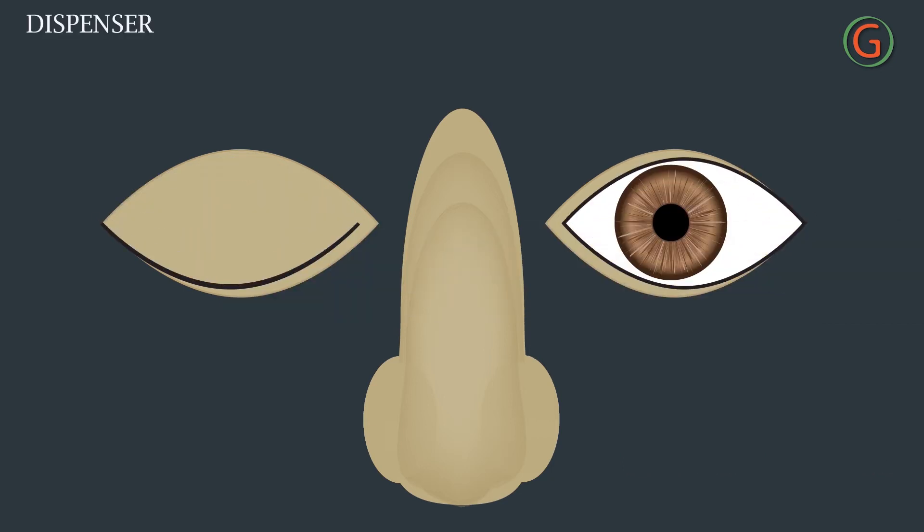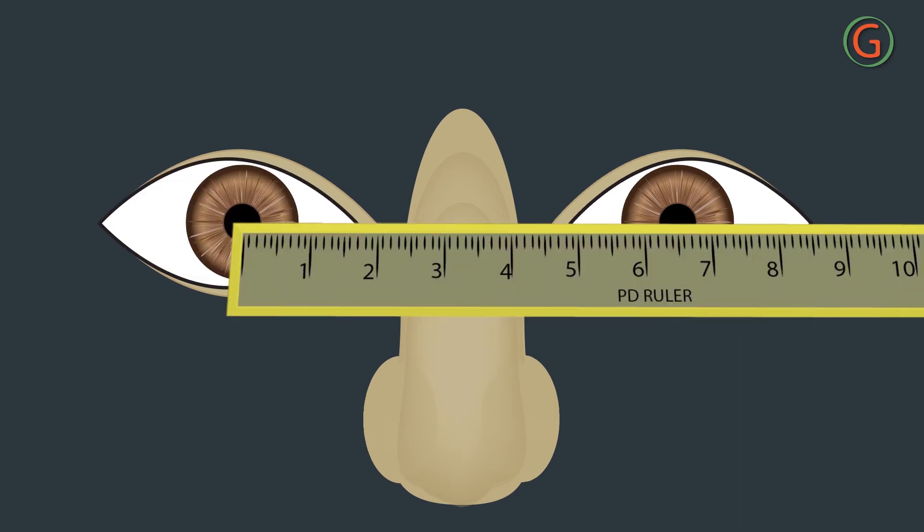The dispenser again closes the right eye and opens the left eye. This step is primarily to recheck and make sure the zero mark is still properly aligned. Then the reading is confirmed and recorded.